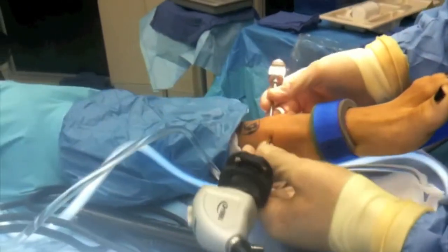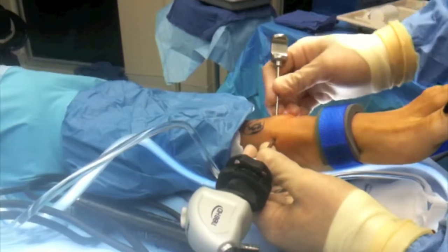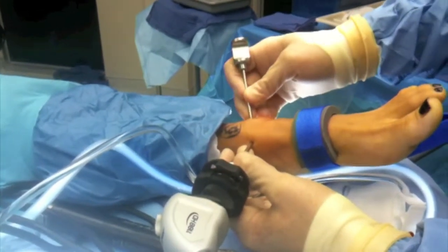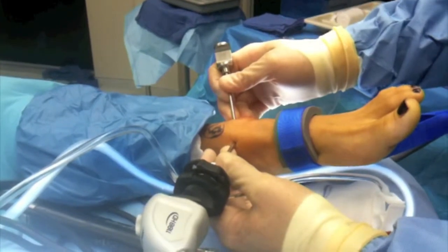Here is the actual scope itself, entering the ankle here. This area is where we put in the instruments to take out the joint pathology — floating cartilage, or whatever else I'll find in there.